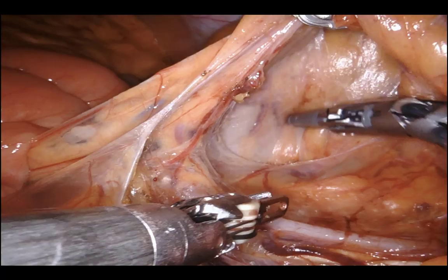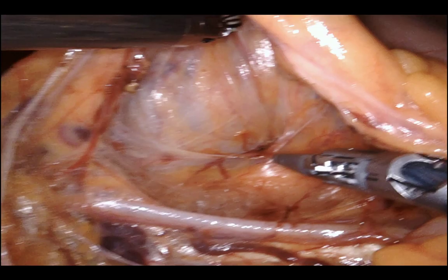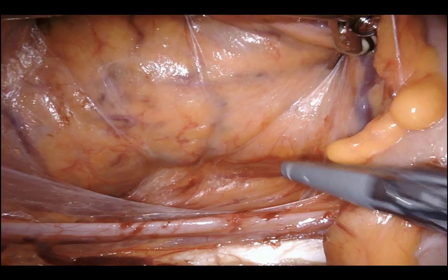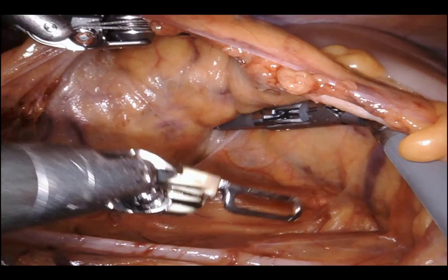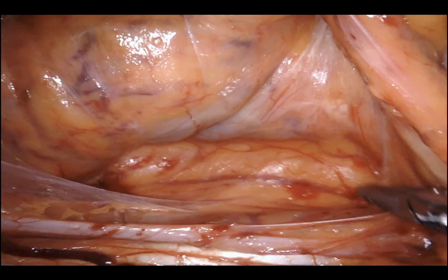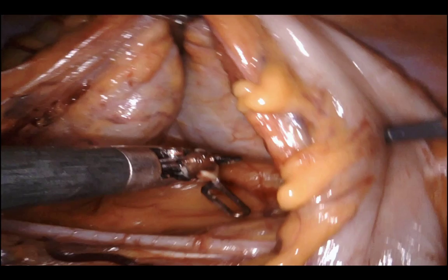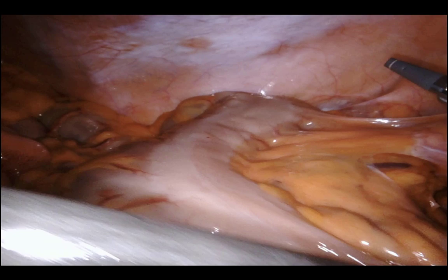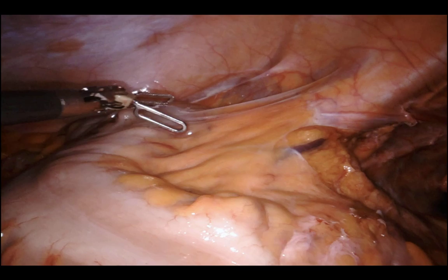This is one reason I don't take the flexure down every case. If you do enough medial mesenteric mobilization — essentially taking the descending meso-colon off the aorta — you get plenty of mesenteric length. Getting lateral length isn't difficult; it's the medial attachments that hold you up. If you take the mesenteric insertion points high enough, the entire descending meso-colon slides into the pelvis, often eliminating the need for splenic flexure mobilization. This lady had a floppy sigmoid-descending colon, so we're getting enough length.